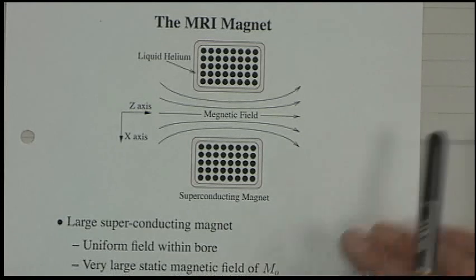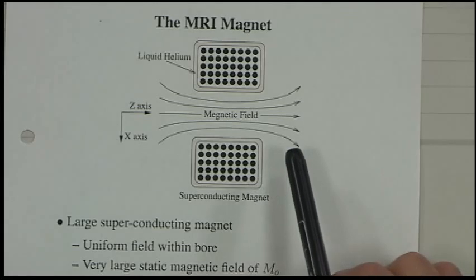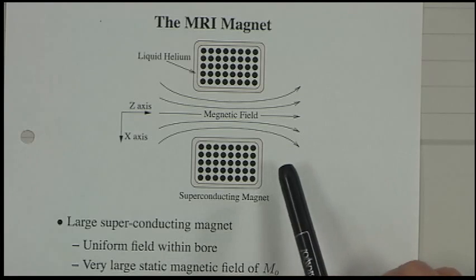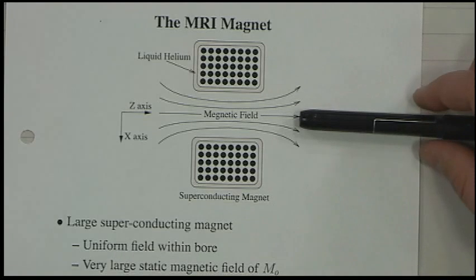What's used clinically is high field strength, and you need it to get the signal strong enough that you can detect it reliably and form a high quality image. So you have to form something on the order of a 1 Tesla field, or 1.5 is pretty standard these days. Clinical MR scanners go up to 3 Tesla.